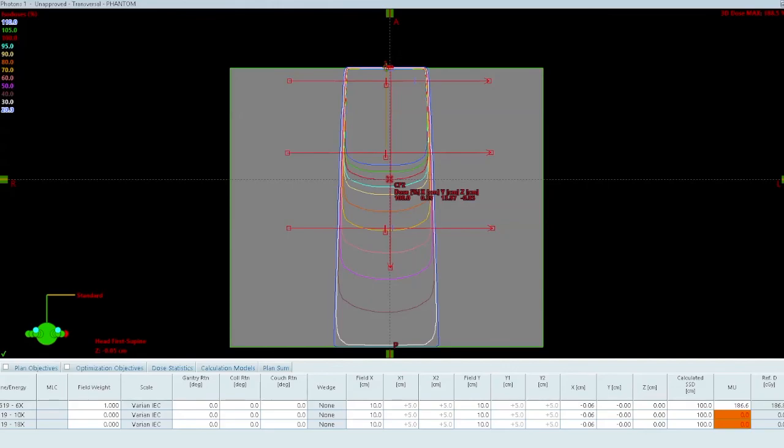So in this video, we talked about isodose lines or isodose curves. We talked about percent depth dose curves, how they change. We talked about beam profiles, the different parts of the profiles, and then we finally talked about normalization, or dose normalization, and how that affects the monitor units, not necessarily the physics of the beam, such as the profile or percent depth dose curves.